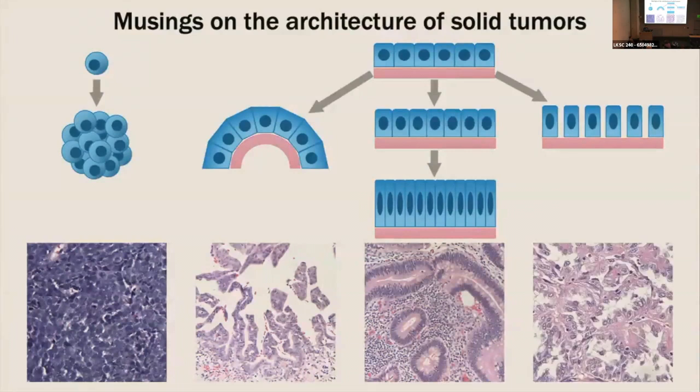So the point here is that individual cells and small areas of cells can have slight morphologic changes, but what we're seeing in architecture is the accumulated effects of these small differences magnified over thousands of cells. So you can spot an overall abnormality at low power rather than rastering through one cell at a time.